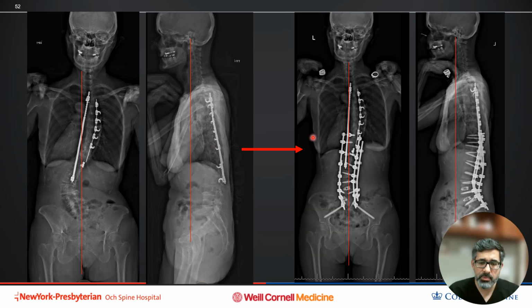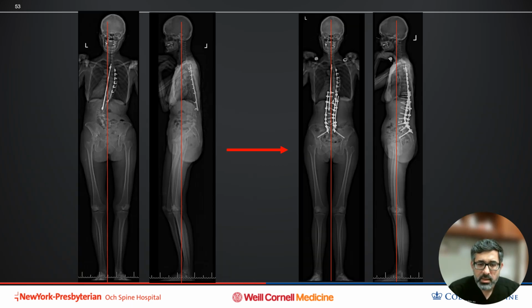And so you can see two separate rod shapes that were planned for this patient. And this is her pre-op to post-op. So even post-op, you see those two different rod shapes. You see the scoliosis in the lumbar spine is partially corrected to match the thoracic scoliosis. And here's her imaging pre-op and post-op. Again, overall looks really well aligned in both planes. She's not bending her hips or knees or ankles anymore. And we have a very nice patient-specific construct now.